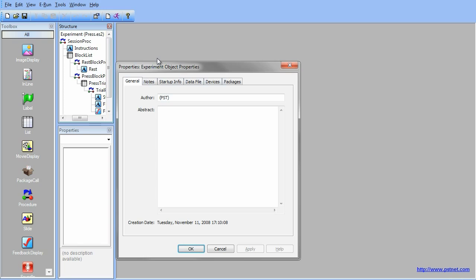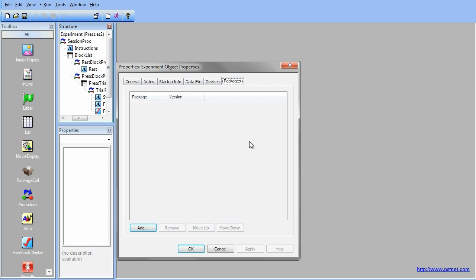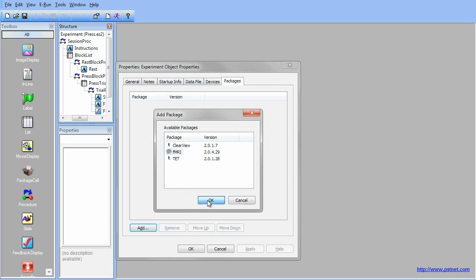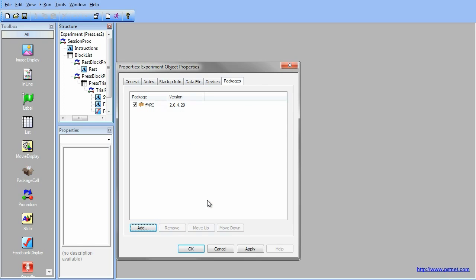Once there, click on the Packages tab to add the ePrime extensions for fMRI package call. This is done by clicking the Add button at the bottom of the screen, selecting fMRI, and clicking OK. Then click OK on the Experiment Object Properties window to accept all changes and exit.